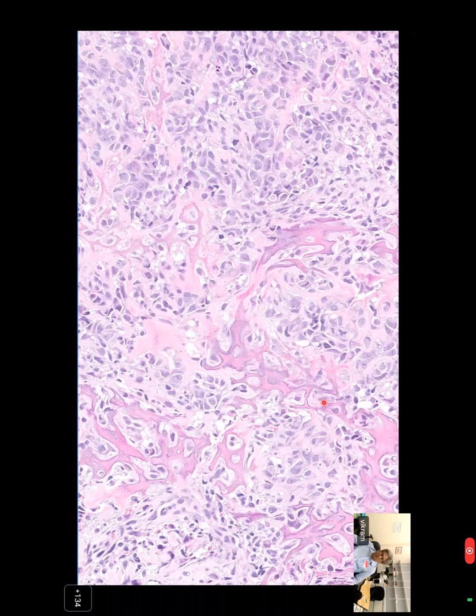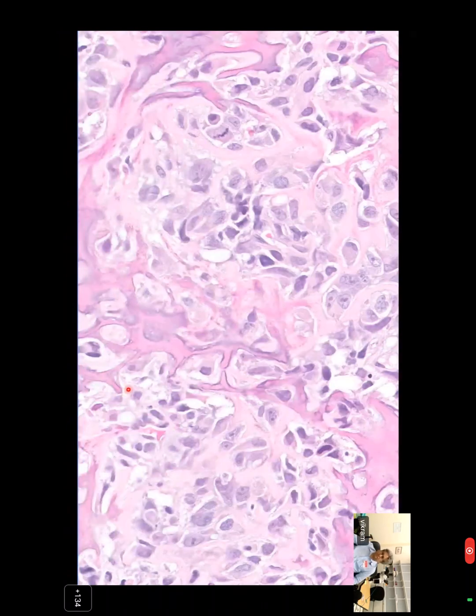So, Manish, are you convinced that these are malignant neoplastic cells? So osteoblasts are highly pleomorphic. Careful with the word osteoblast. When you say osteoblasts, you're referring to a benign cell. You're referring to the cell that I showed you in the last case, those plasmacytoid cells. I don't see classic osteoblasts here, right? So I would refer to these as neoplastic cells and not osteoblasts. Pleomorphic neoplastic cells are there. Yeah.